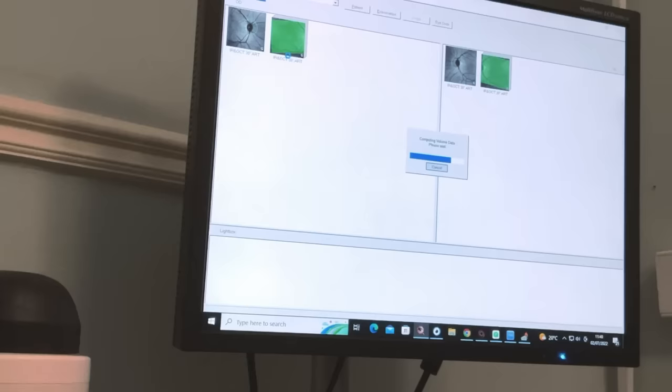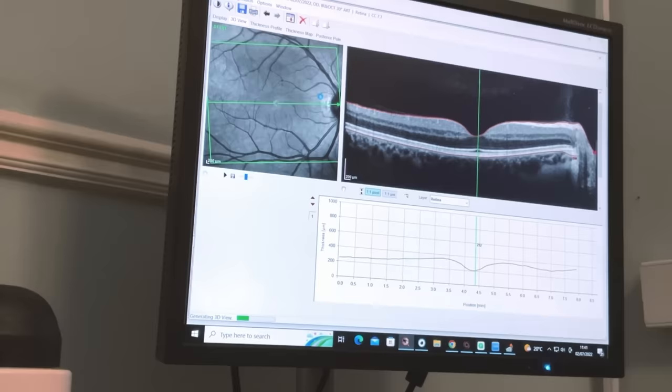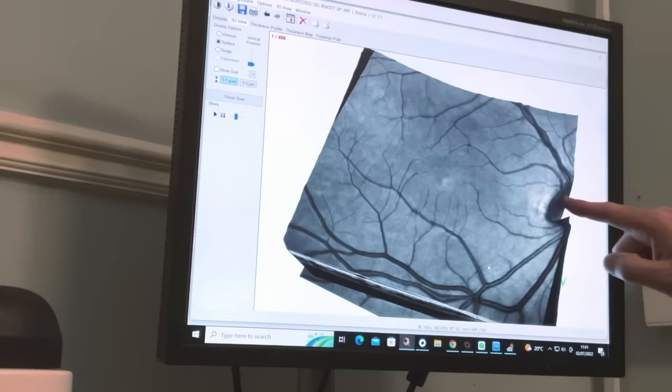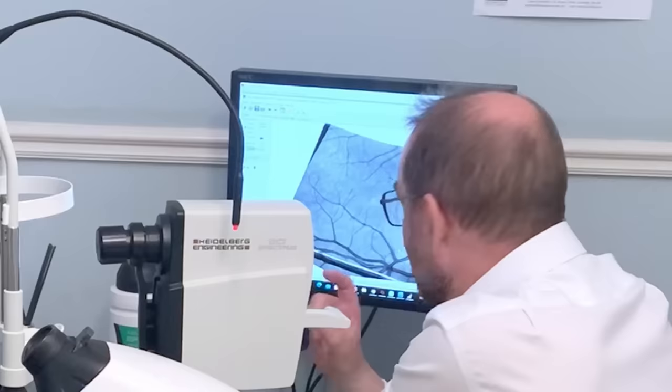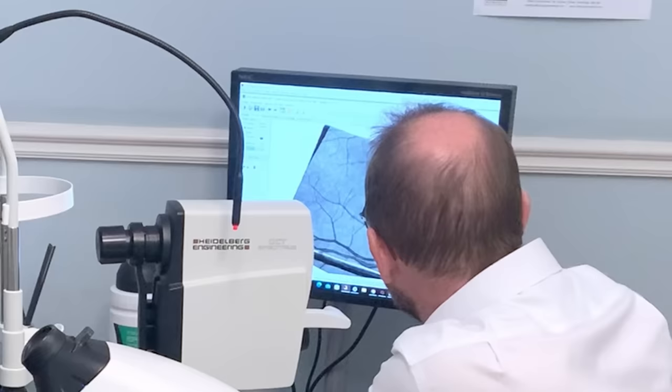And then this other scan that we did, the best way to see it is the 3D view. If we slide this down and make it a bit bigger, there's your optic nerve, which we were just looking at. And here is your macula. This is where all your detailed vision is. When you want detailed vision, you're looking through your macula, where the highest concentration of the rods and cones is. So this is the bit that we're interested in here. We've got a cross-section through it, so this is the layers of your retina.